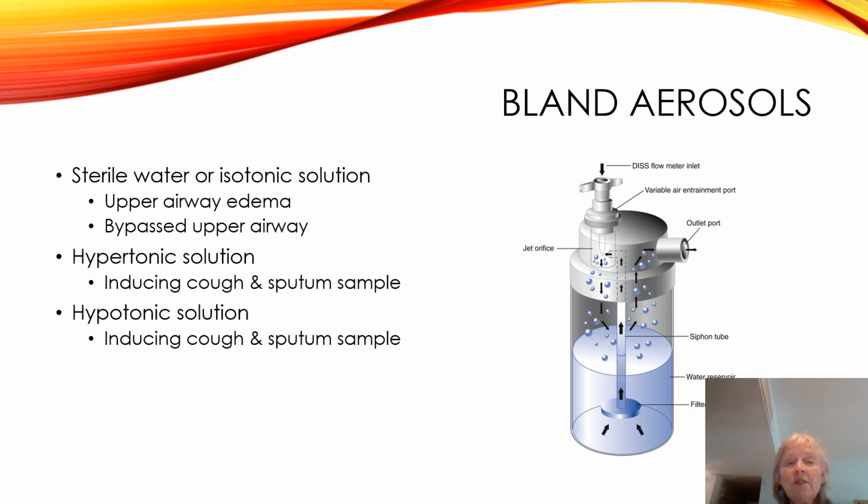So why do we use these, or where can we use these? We can use these in the upper airway. If you remember with peds, Trish talked about croup and epiglottitis. This is an upper airway process, and what we need to do is to reduce the swelling that's going on in the upper airways. So we can provide a cool, what we call a cool mist. We'll talk a little bit about that on the next slide, but we're delivering this bland aerosol to the upper airway.